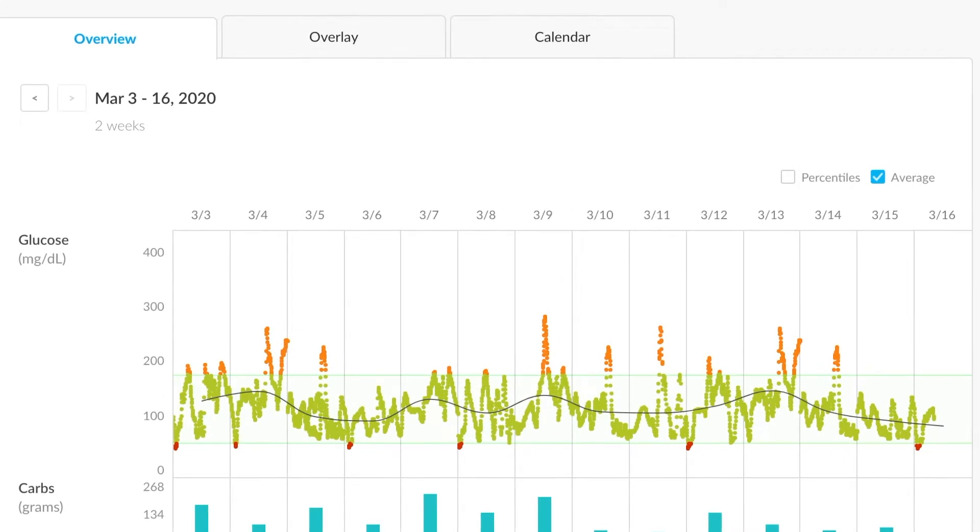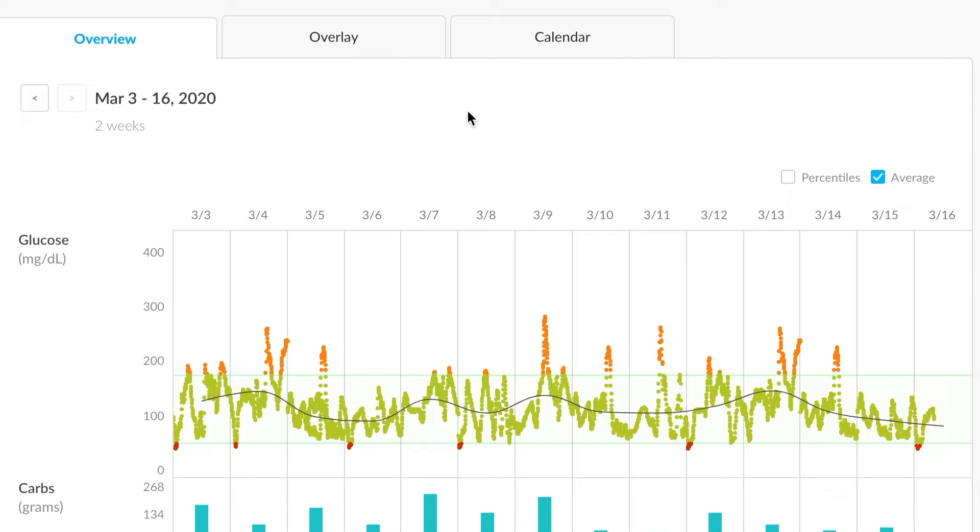Within the graphs section, there are a few subsections here: overview, overlay, and calendar, each of which give you a different representation of the data.